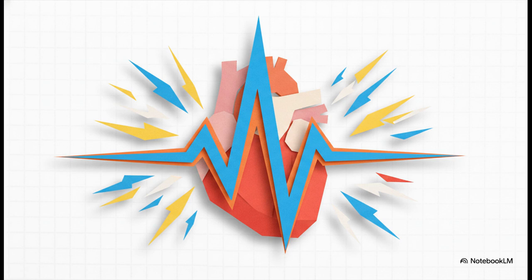Next up is the QRS complex. This is the main event, folks, ventricular depolarization. It's huge because the ventricles are the powerful pumping chambers of the heart, and it actually happens in two major phases. First, the initial depolarization of the interventricular septum, followed immediately by the simultaneous firing of both massive ventricles. Because this happens so incredibly fast in a healthy heart, a normal QRS complex lasts only 100 to 110 milliseconds or less. It's just a quick, lightning-fast, powerful spike.